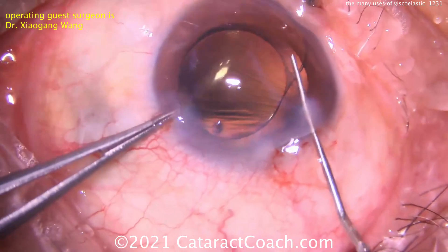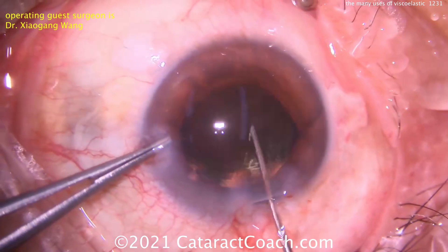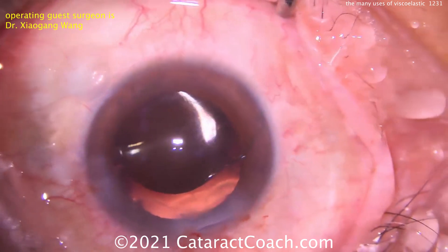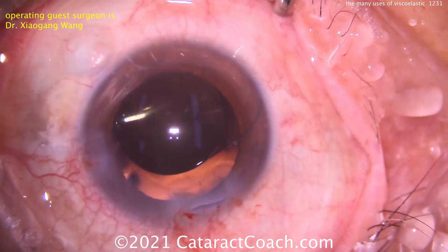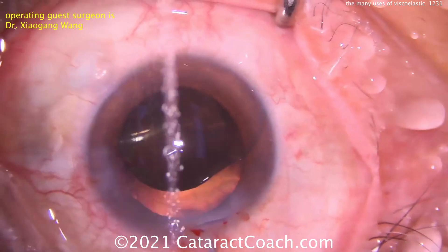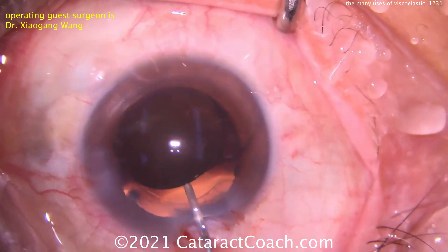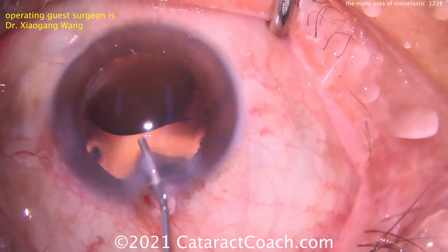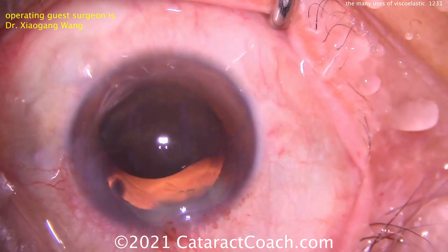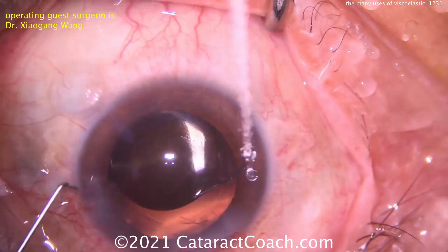Now we use viscoelastic — or OVD, ophthalmic viscosurgical devices as we also call them — for many aspects of the surgery. It's very helpful to maintain space, to protect tissues, and to lubricate. In this case, we're going to use it to maintain that space. More viscoelastic is going inside the eye, and then the haptic can be placed in the capsule bag. First go behind the optic and really inflate the bag, then go above the optic as well, injecting more viscoelastic to deepen the anterior chamber. Now it's going to be a lot easier to deal with — if you go in with just that hook, it's going to be a lot easier.